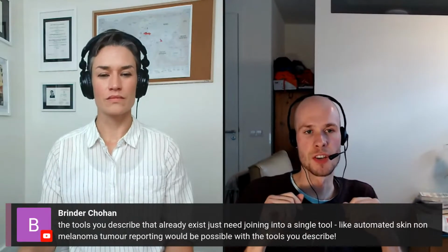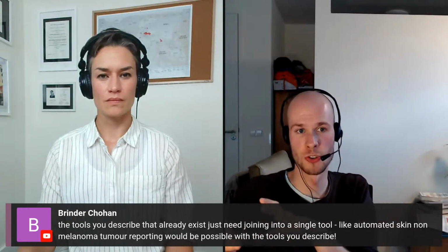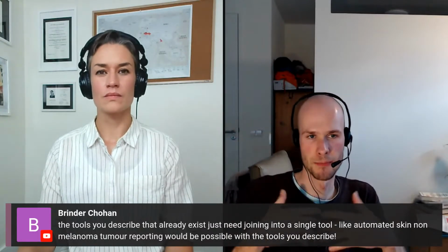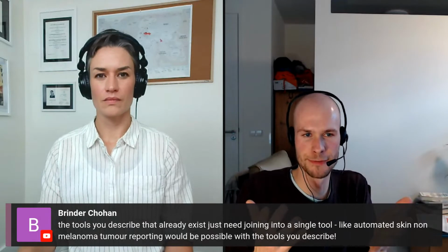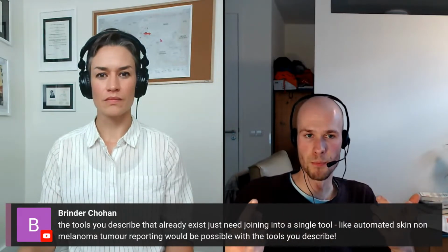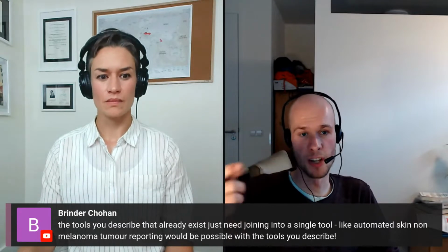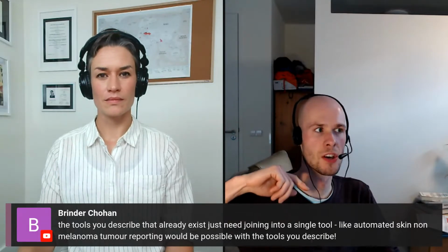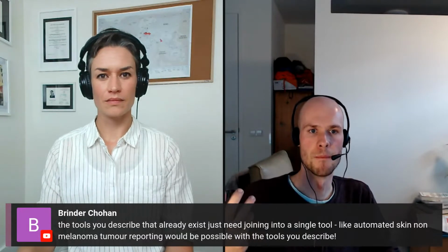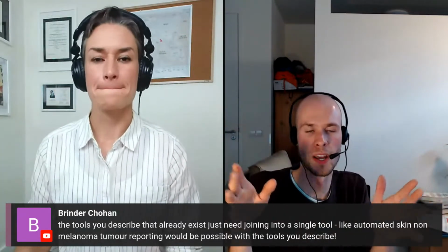I think this is a good way to think of it. A classification model spits out one value at the end, and this value is a probability of that particular picture belonging to a certain class. If it's very high, then it's very likely that this image belongs to this label. But a segmentation model spits out per pixel a probability value of that pixel belonging to that object. So it's really an underlying model difference that causes this change in behavior. You either classify the entire image or you can classify pixels within an array within the image.